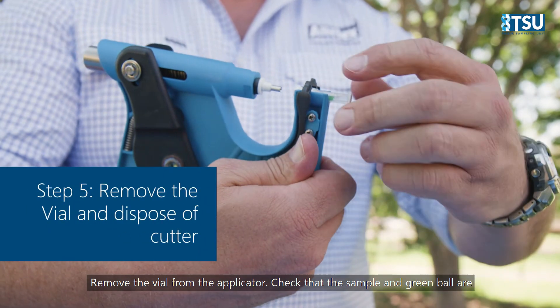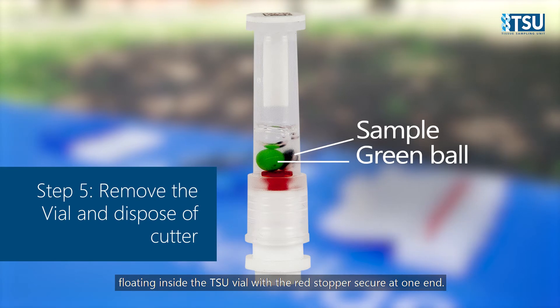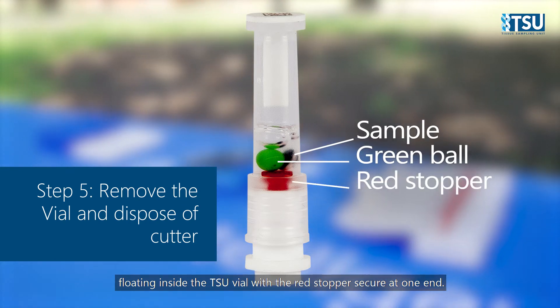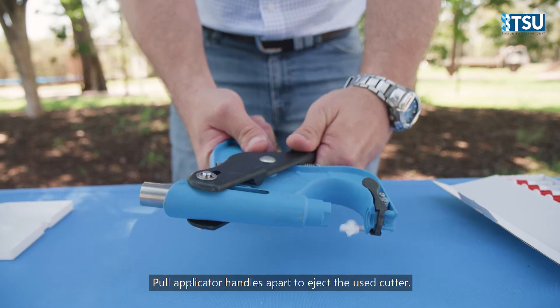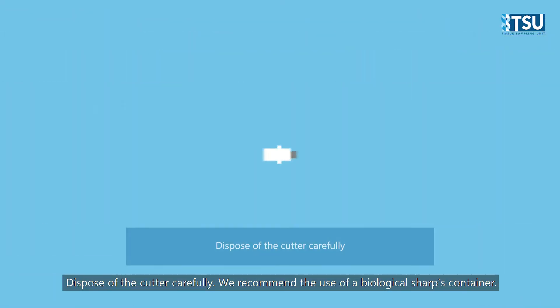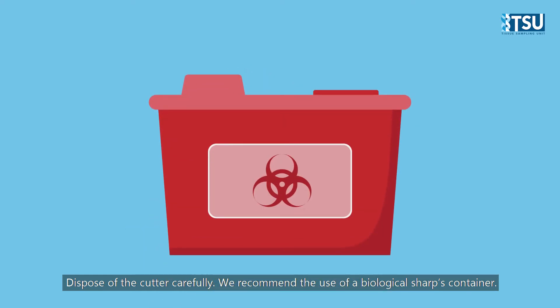Remove the vial from the applicator. Check that the sample and green ball are floating inside the TSU vial, with the red stopper secure at one end. Pull applicator handles apart to eject the used cutter. Dispose of the cutter carefully. We recommend the use of a biological sharps container.